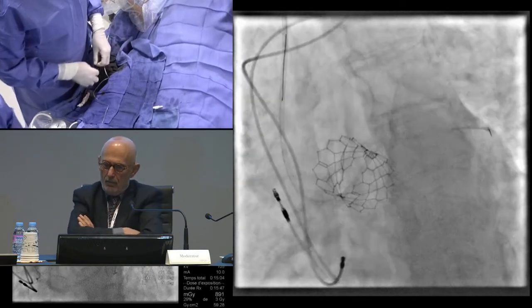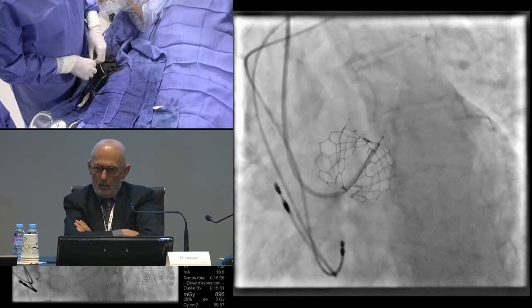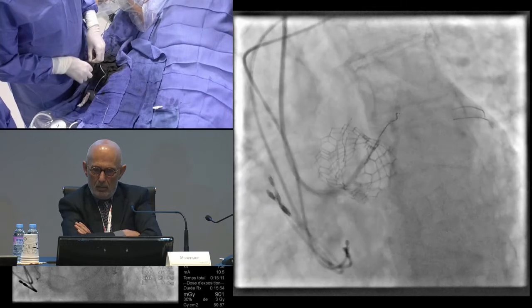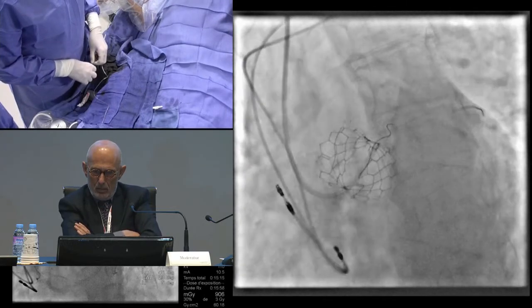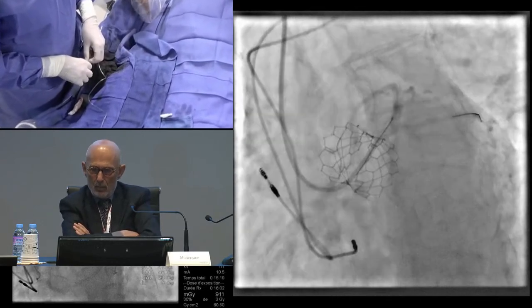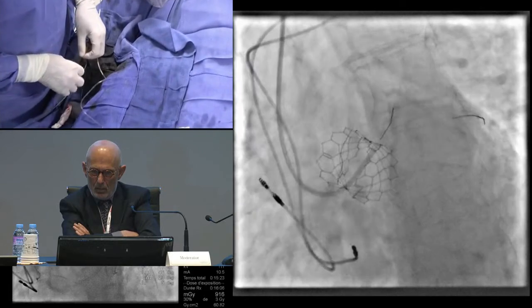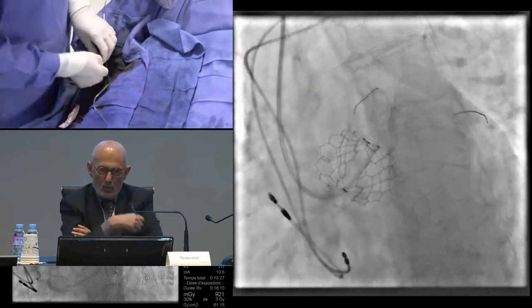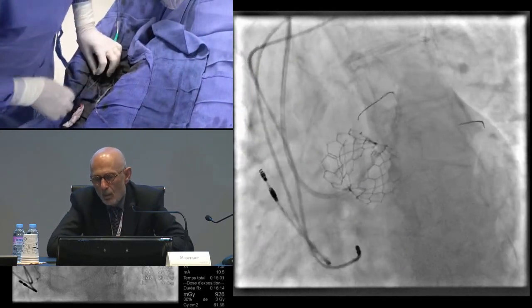Concerning the double stent strategy, we have several options. The first option could be to use a TAP, in other words, to place a stent from the left main into the LAD, and then after doing the post dilatation, recross the stent and place an additional stent at the ostium of the circumflex. This is possible to do.